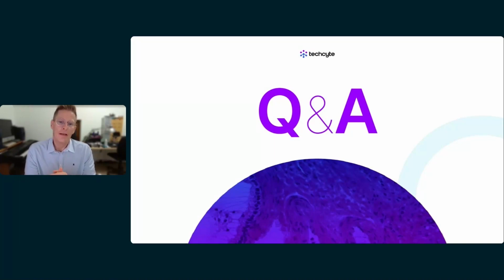Esther asked, would the AI identify an unusual morphology or something that it was not trained to recognize? No. Short answer is no. The AI is able to recognize the objects that it's been trained to recognize. Even AI isn't a silver bullet. There is a version of AI called unsupervised learning, where you simply feed it data and it spits stuff out. But we obviously don't do that because we need to control and we need to feed it what we want on the output. And so we teach the algorithm by giving it hundreds of thousands of examples of what we want it to learn.